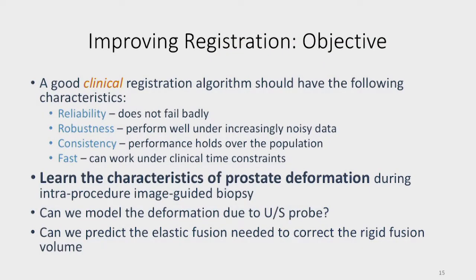Okay, so 17 years ago, I introduced a program utilizing real-time segmentation for brachytherapy. And we published after that a paper on deflection and deformation, the majority of which happened with needle insertion. So it wasn't the setup and the template registration, it was actually the needles pushing the prostate and deforming it. So how do you compensate for that? Or can you come up with a mechanism to compensate for that during the procedure?